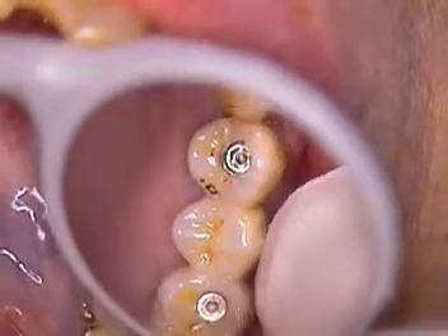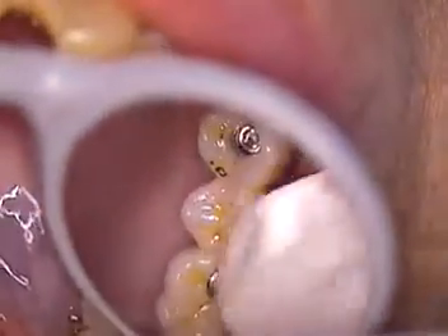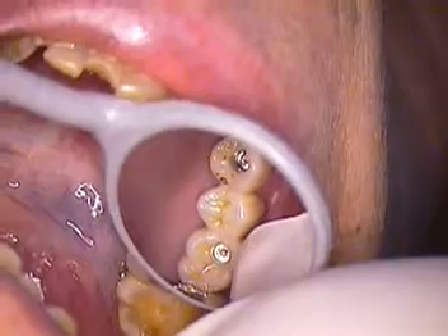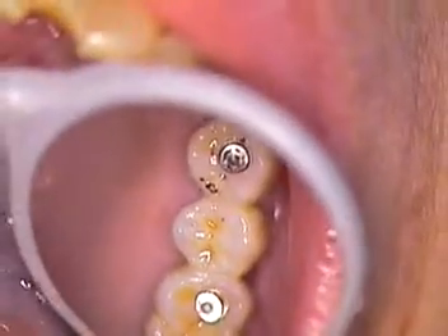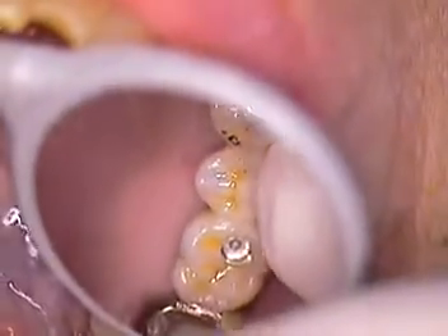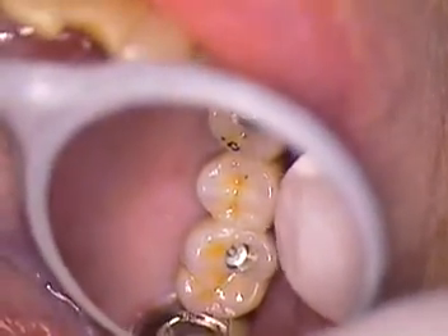And it is a bone-level case. Two implants holding three teeth in place without any metal framework. This is completely scanned as well as designed on software, as opposed to waxing, casting, and metal, then building in porcelain. So there's the least amount of susceptibility for any fracture to occur.